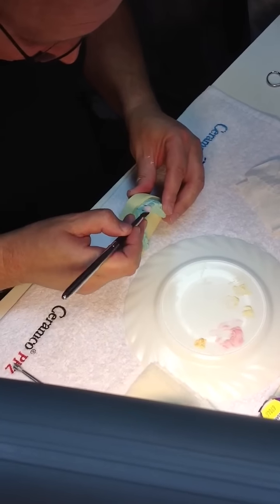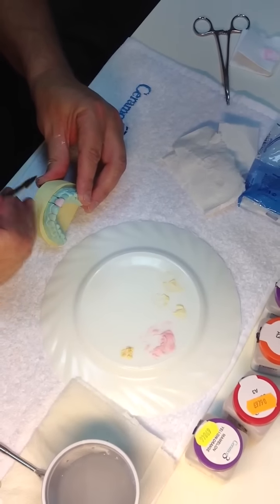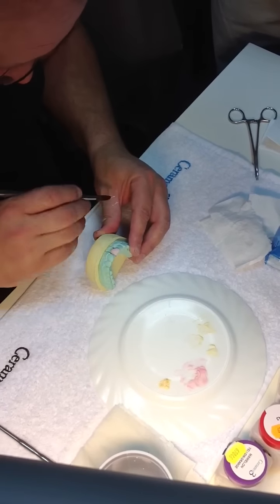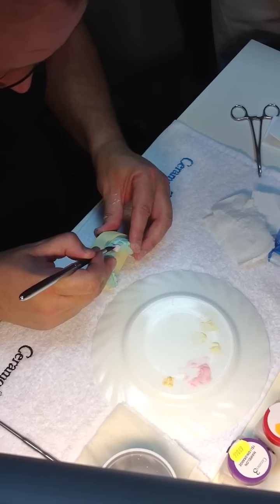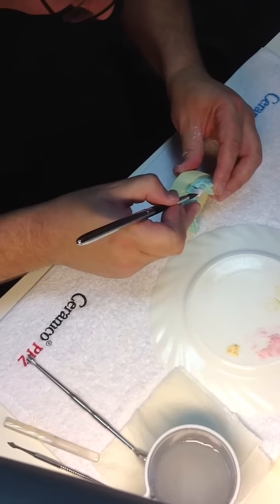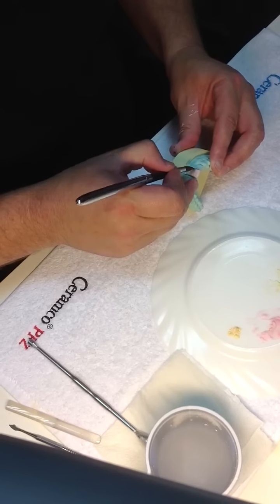Right, just going to chamfer back. Now I'll cut back the dentine. You can use instruments if you prefer to cut back with an instrument. If it's more convenient for you to use an instrument to cut back the dentine, then please do.